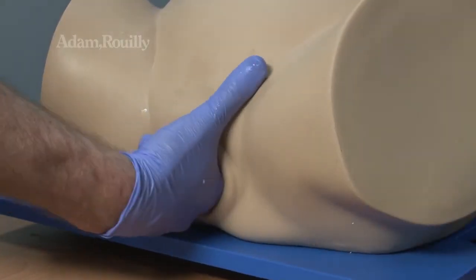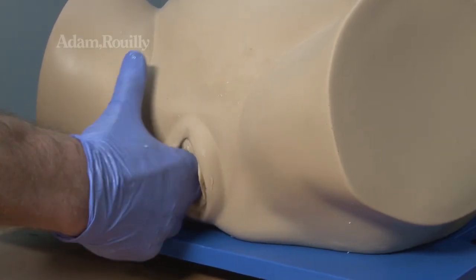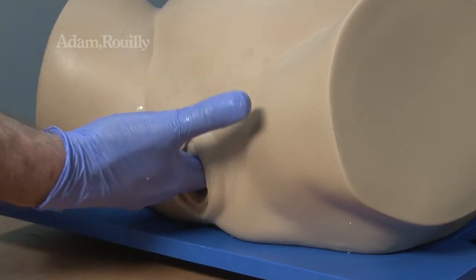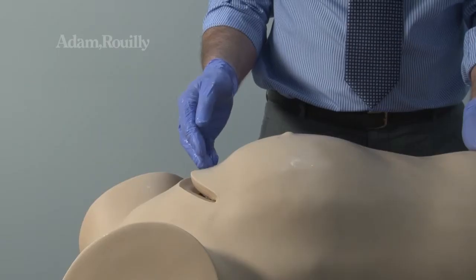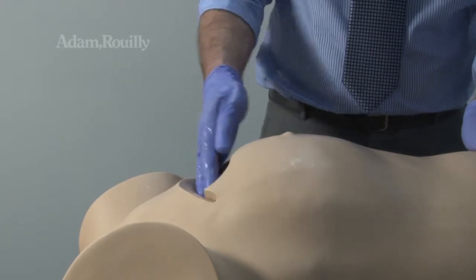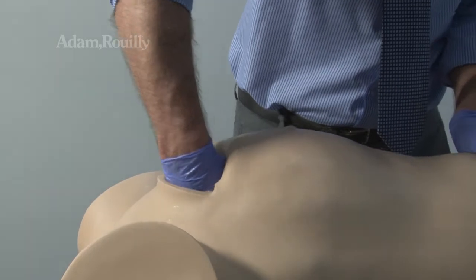During use, vaginal examination may be performed to ascertain the fetal head position. The fetal head can then be manually disimpacted.